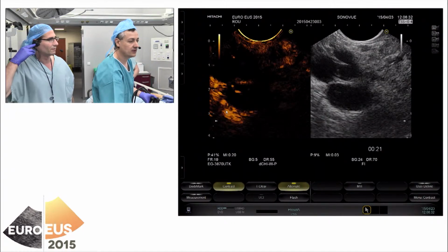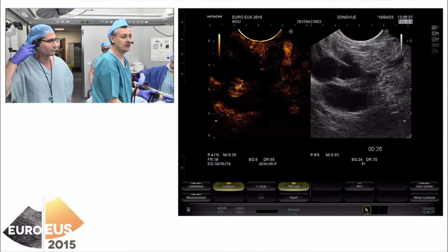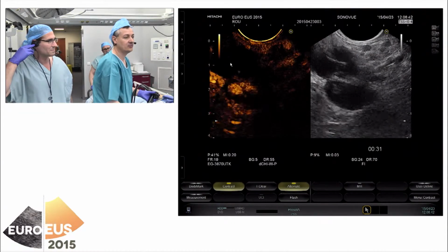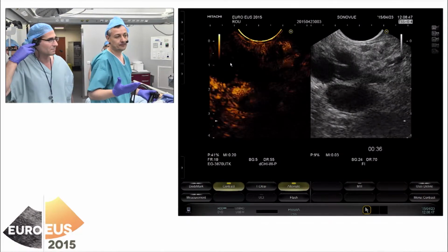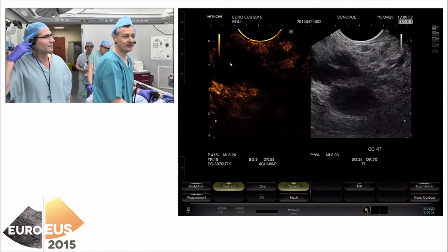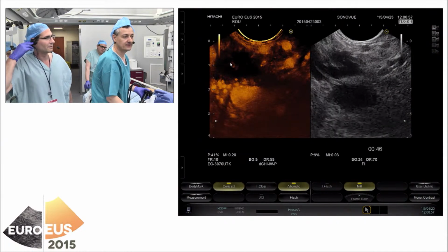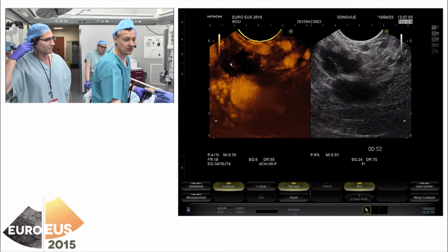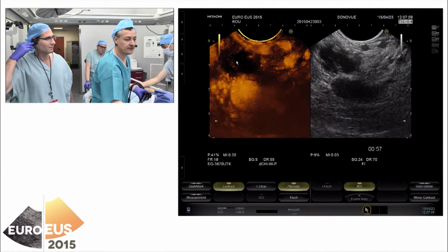Now you see the contrast already, so it started to show here a bit, but also in some of the structures. Now you see it here. It's the splenic vein, and we have to wait a bit for the septations. It's not much. Do you ever use a flash? We will use a trick that Christoph showed you. We can use the microbubble trace imaging. So you see, it's not a lot of signal inside the septations. You see only the splenic vein enhancing here, and not a lot of signal.